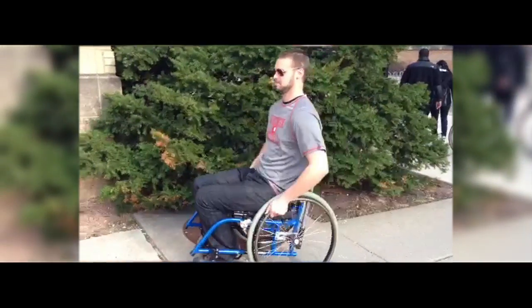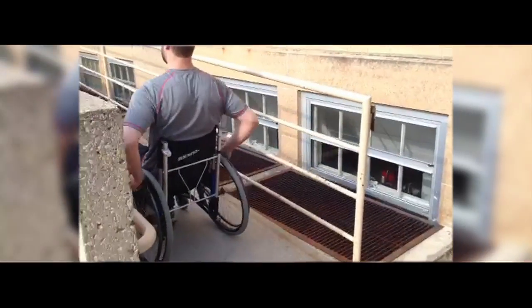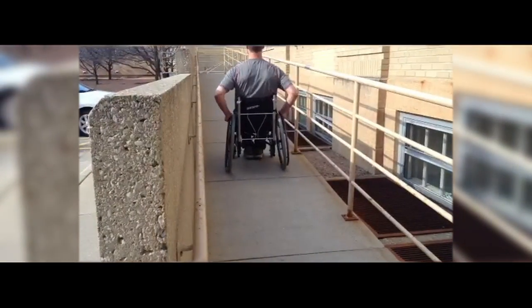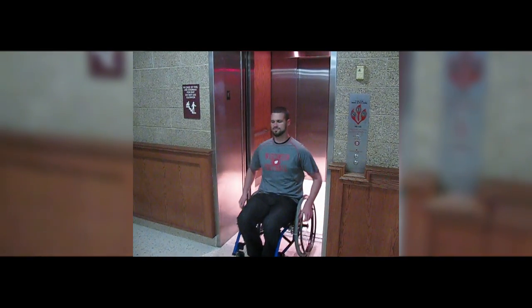Currently there are two solutions for wheelchair users to get up and down a staircase: ramps and powered lifts. Ramps, although they are user-powered, are lengthy and bulky in order to limit the effort needed by the user. This poses a problem when a wheelchair user needs to go up a significant amount of stairs in a confined space. On the other hand, powered lifts take up a lot less space but are very expensive.